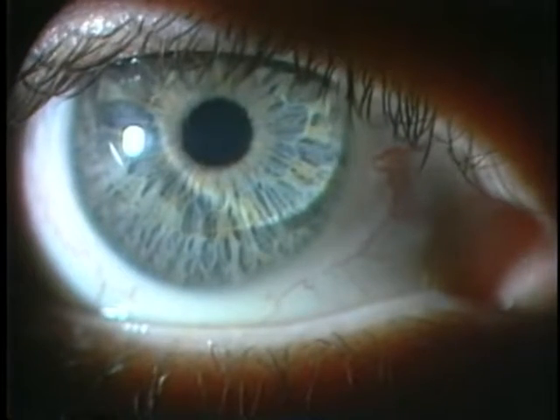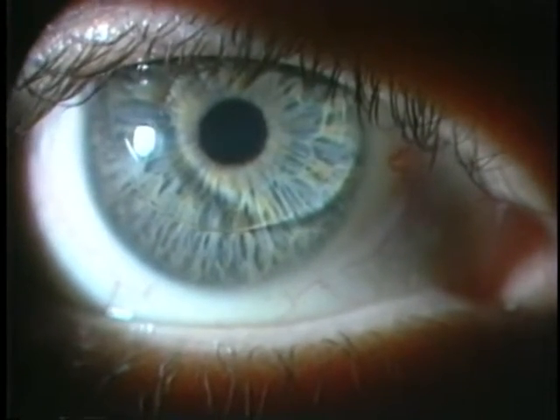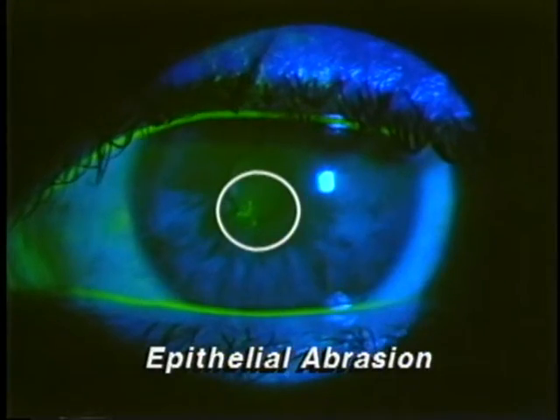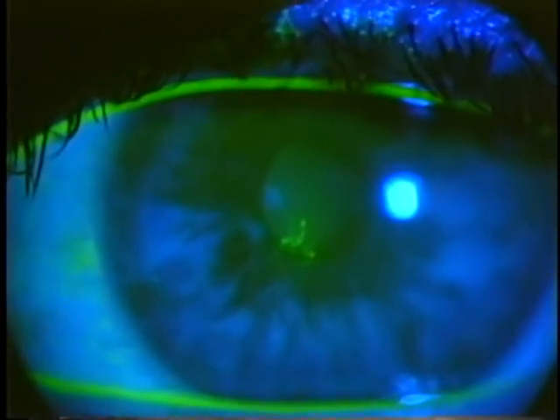Diffuse illumination is used in combination with low magnification to observe the overall lens positioning of this RGP lens. There is good movement on the blink and good centration. Moderate magnification provides a better view of the lens surface and tear exchange at the lens edge. Fluorescein evaluation of the same lens reveals a slightly steep fit with an area of central pooling or clearance and a light zone of mid-peripheral bearing. The peripheral curve system appears as the bright circular ring at the lens edge. In another example, diffuse illumination is helpful for viewing an epithelial abrasion resulting from PMMA lens overwear. The coalesced area of central corneal staining is enhanced by the use of fluorescein dye.